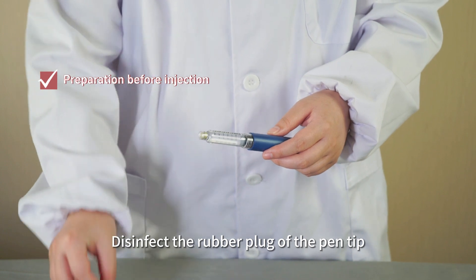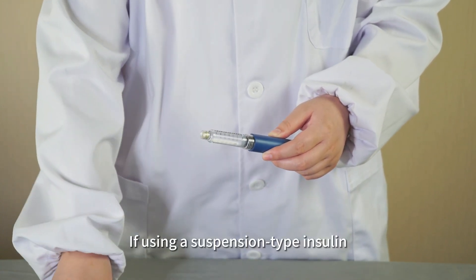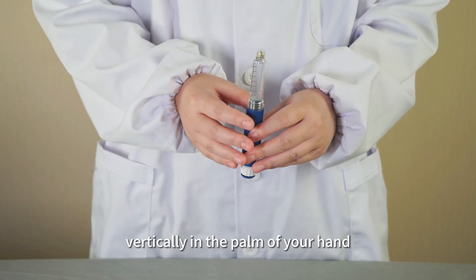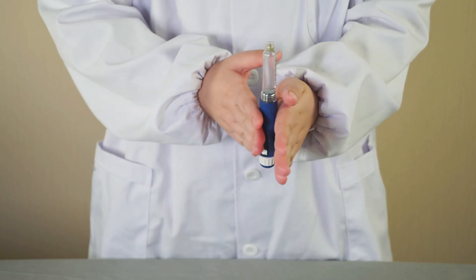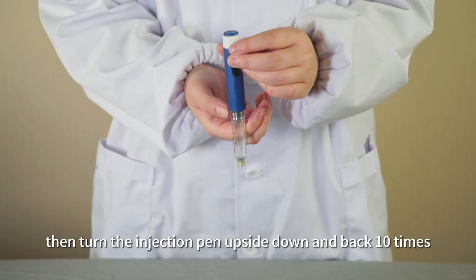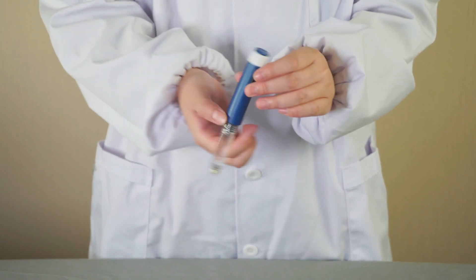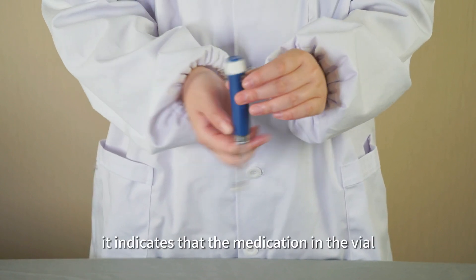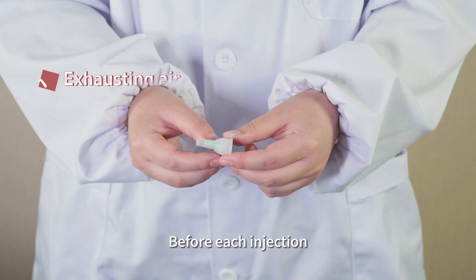Disinfect the rubber plug of the pen tip with an alcohol swab if using a suspension type insulin. Make sure to thoroughly mix it. Place the injection pen vertically in the palm of your hand, gently roll it 10 times. Then turn the injection pen upside down and back 10 times. When the insulin turns into a uniform cloudy white liquid, it indicates that the medication is thoroughly mixed.